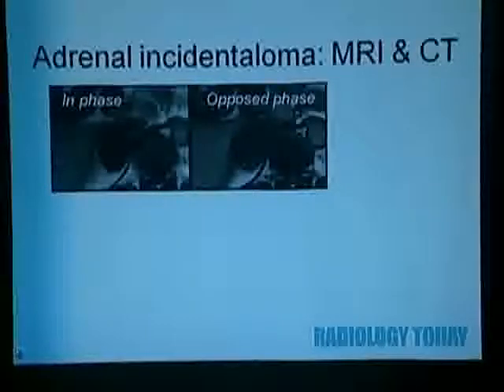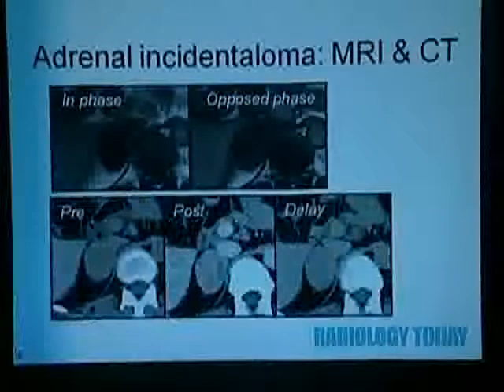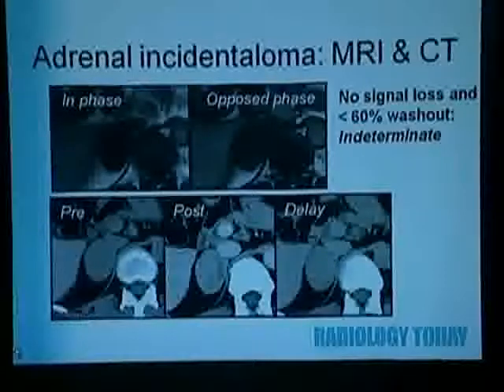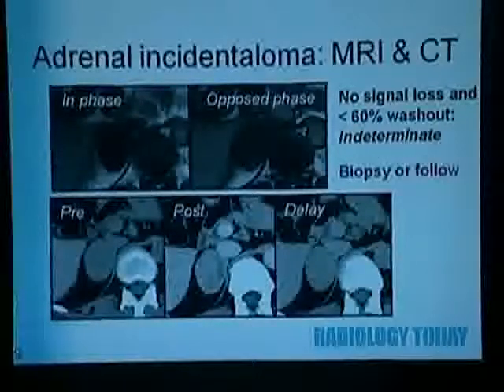Here's a more complicated case where they first got the MRI, and we did not have significant signal loss. And then the washout CT also demonstrated insignificant washout. This mass is indeterminate. And on our algorithm here, we move on to following this or biopsying this lesion.